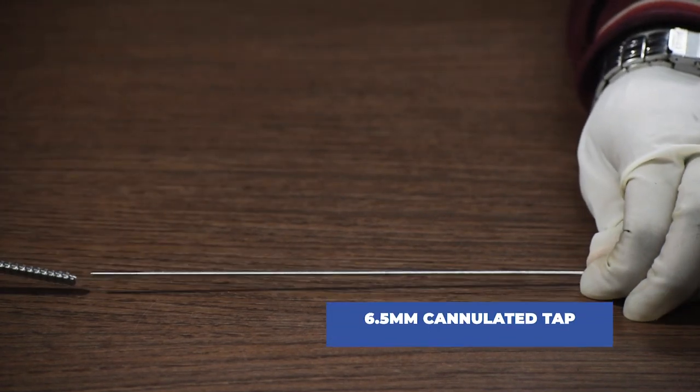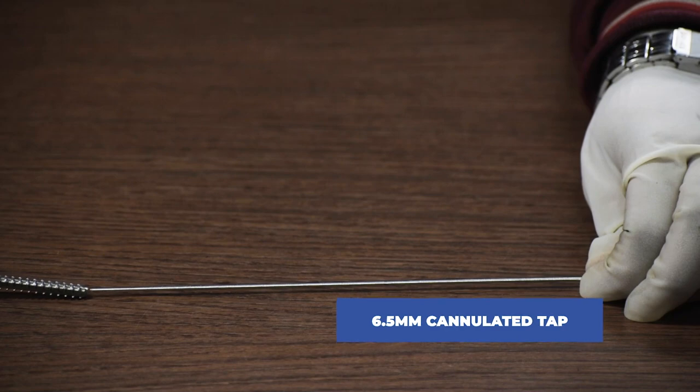After checking the measurement, we will use a 4.5mm cannulated drill bit to drill. Once the drilling is done, we will use a 6.5mm cannulated tap to tap.